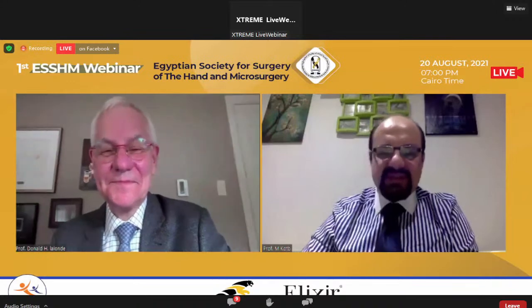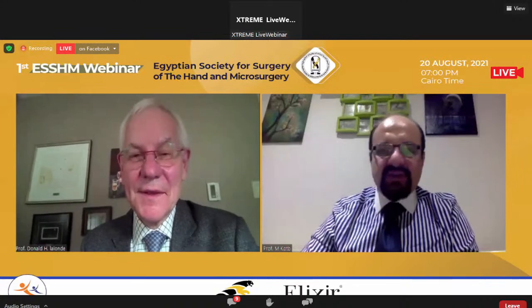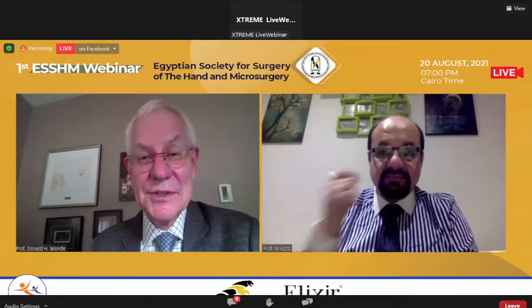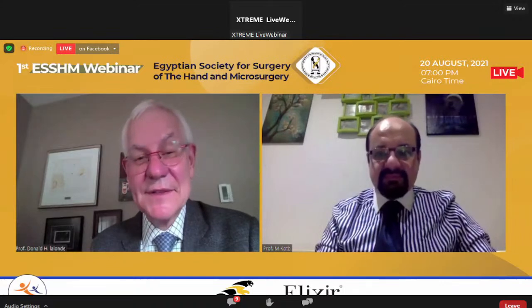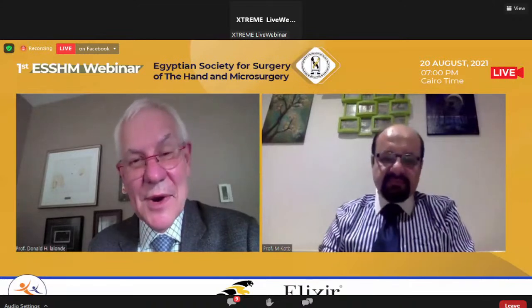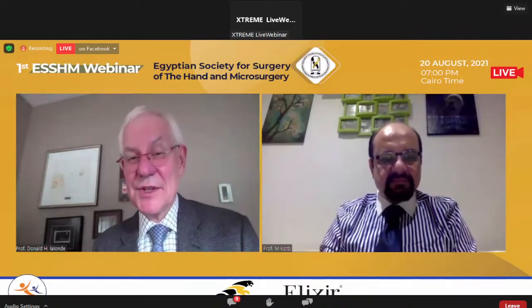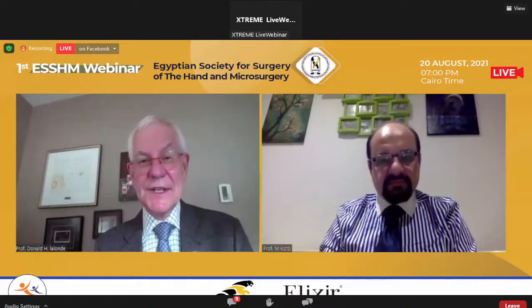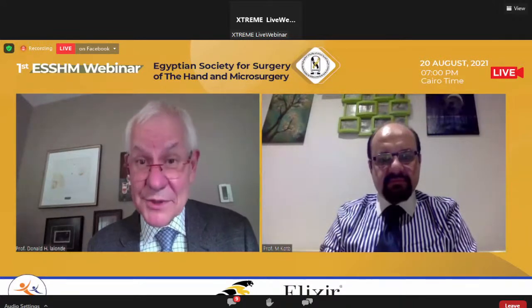About burying the tip of the K-wire. So one question, aren't you afraid of wire migration? Yeah, I've had K-wire migration. I've had it all. I've had to go chase K-wires. I've had some infections with K-wires coming out of the skin. I've had some infections with K-wires under the skin. But I have learned that if you get patients to not do what hurts, you don't get K-wire infections. And yeah, I'm going to have to chase the occasional K-wire with surgery, but I'm also going to have to take out the occasional plate with surgery.